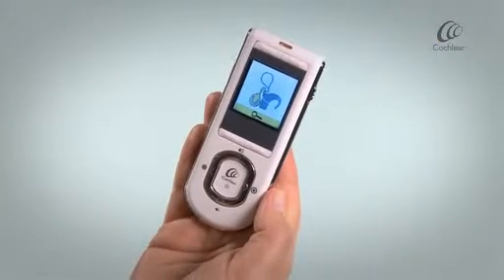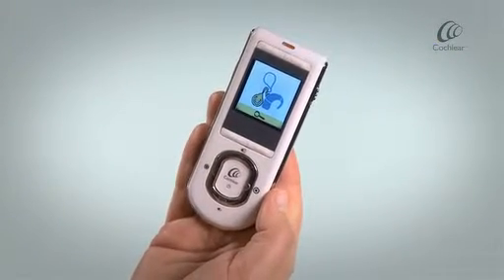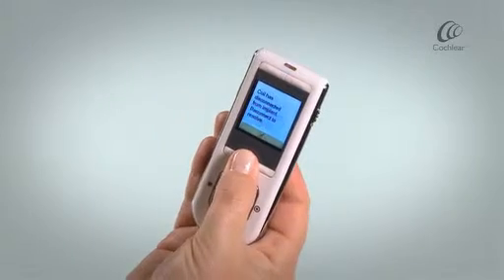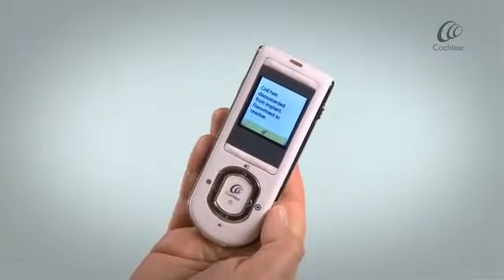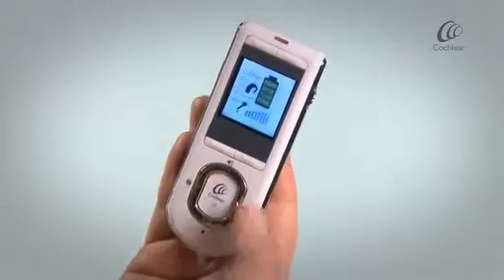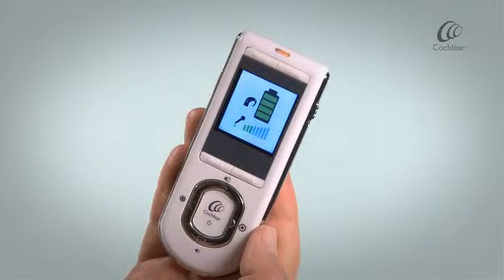If an alert is present, you can access troubleshooting information by pressing the lower left soft key. Press the Cochlear button again to see the processor battery and input audio levels.